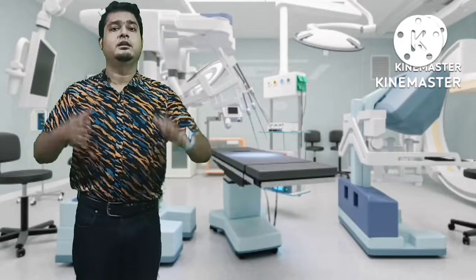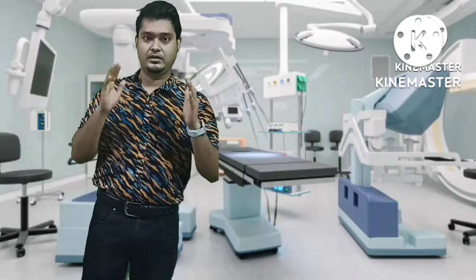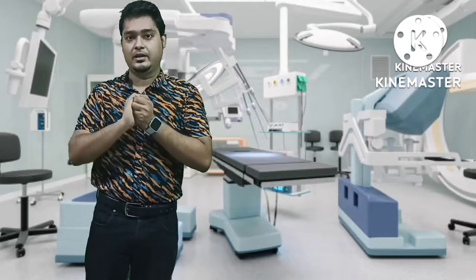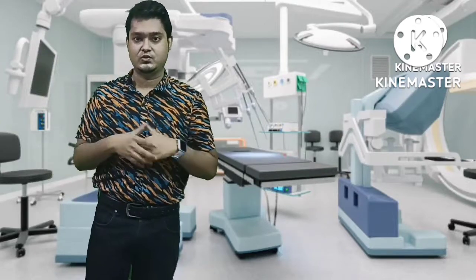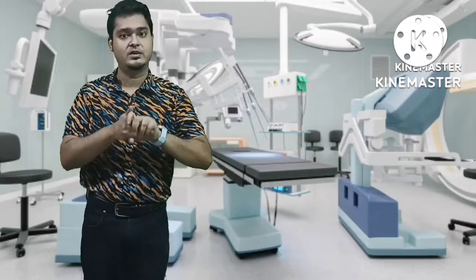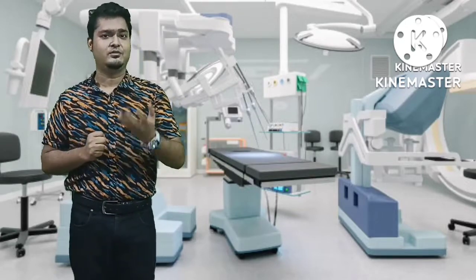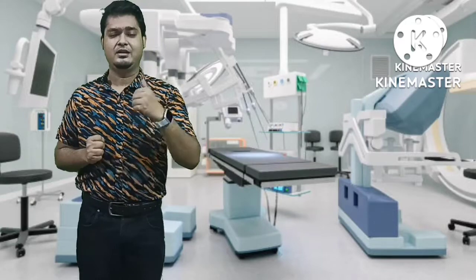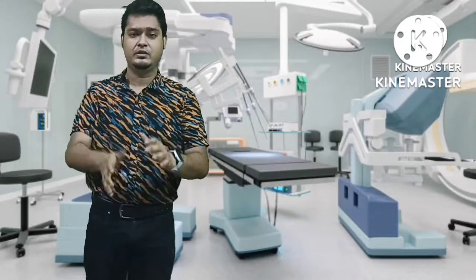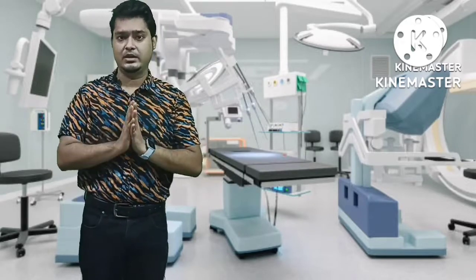Generally, we place the patient's arms above the head, and we always instruct the patient to hold the hands together in order to prevent movement of the chest wall or the pectoralis muscle. If the chest wall moves during the examination, image artifacts will be created that will have a bad impact on our images and destroy them.